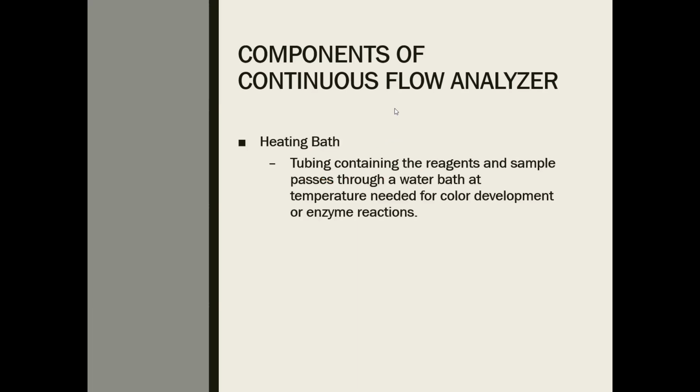Or we said heating bath, well, the very purpose of heating bath is a tubing connecting the reagent and the sample passes through a water bath at a temperature needed. Okay? Since there is still a requirement in the temperature, hindi mo na kailangan mag-incubator sa conventional or sa manual method because our automated analyzers, for example, Auto-Technicon, is capable of performing the incubation inside the machine. Okay? So that is our continuous flow analyzer.